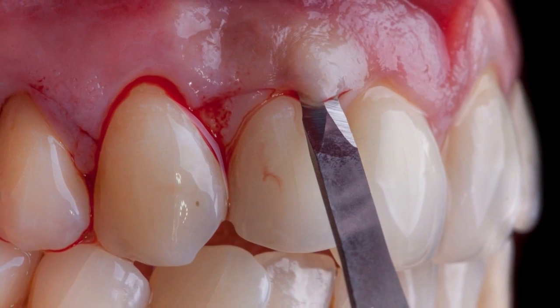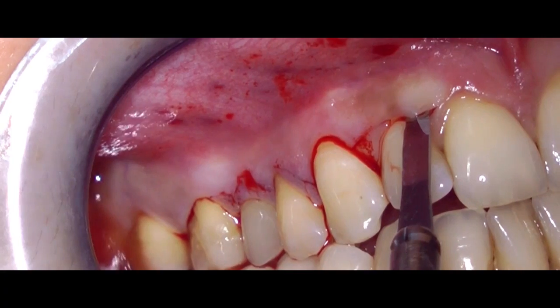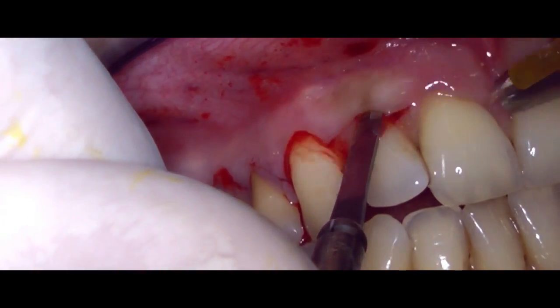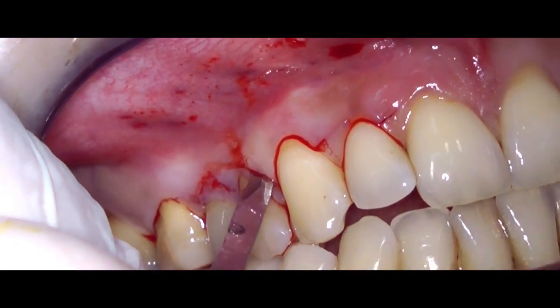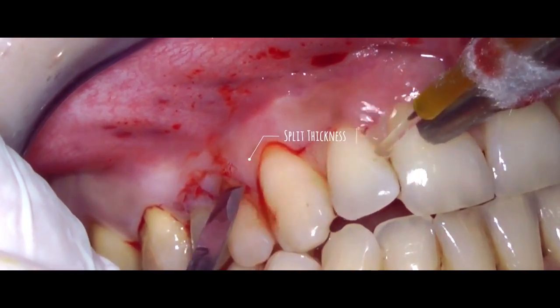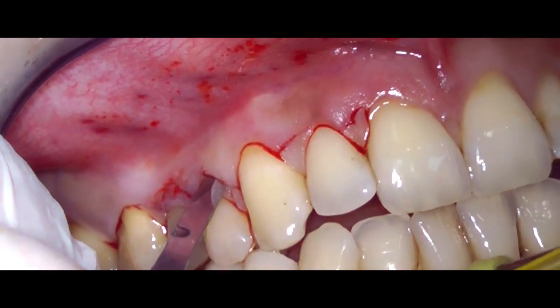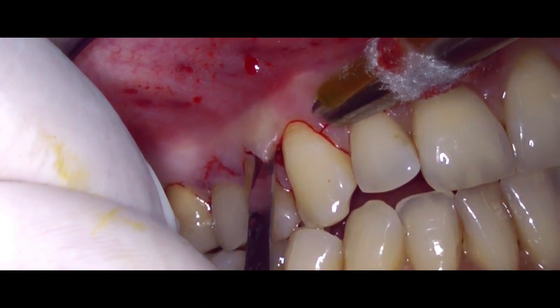An important aspect of this surgery is the variable thickness of the flap. The surgical papilla are created by split thickness. As we can see here, this blade position allows for the splitting of the flap and we keep going like this until we reach the probable margin of the adjacent teeth.